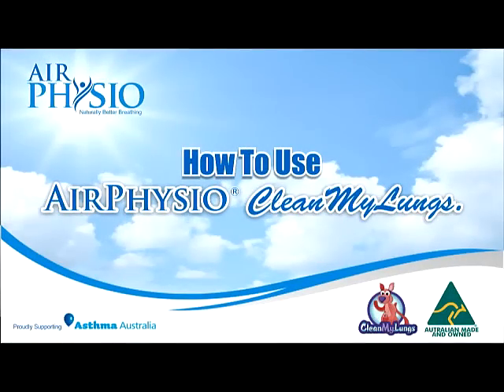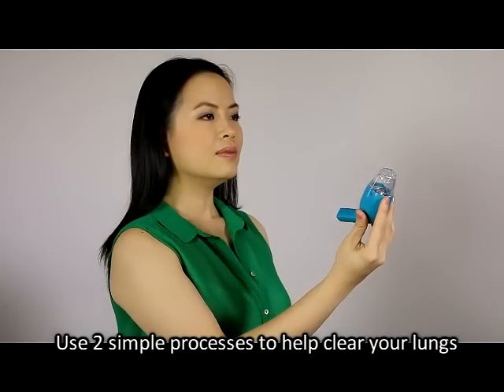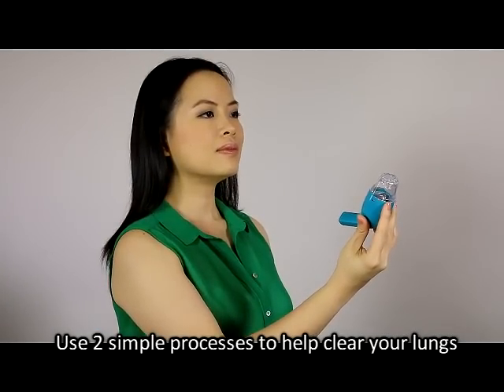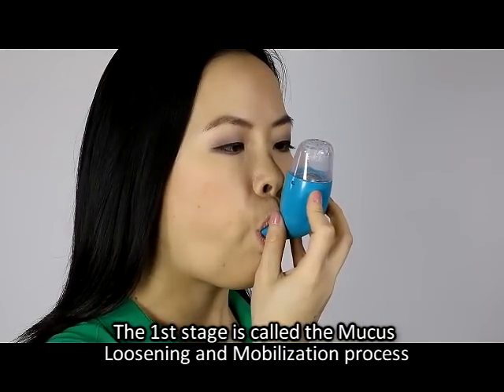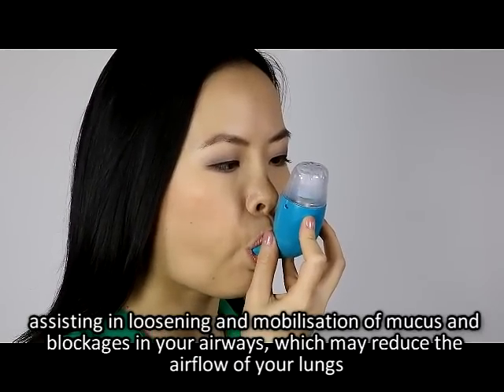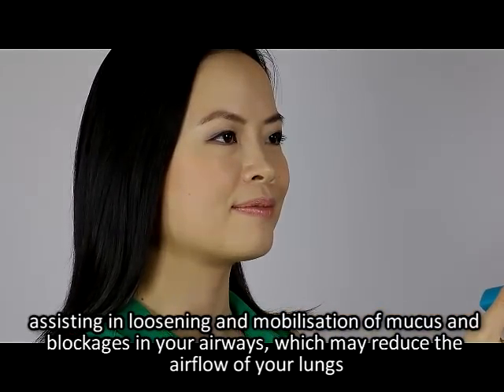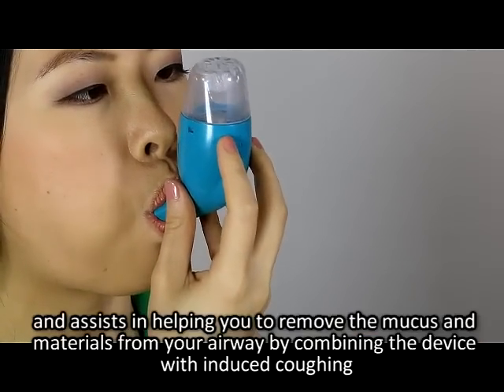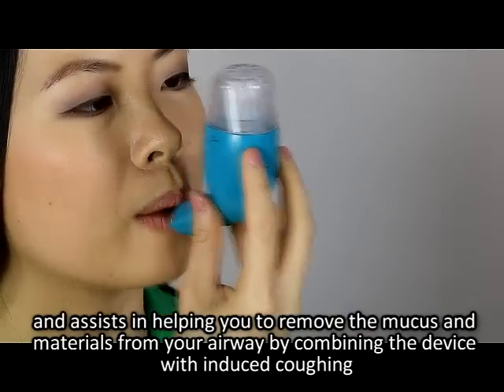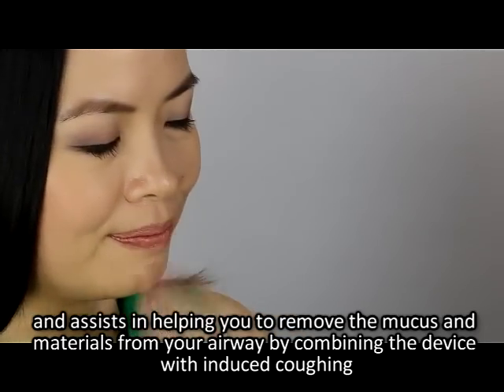How to use AirPhysio to clean your lungs. Two simple processes help clear your lungs. The first stage is called the mucus loosening and mobilization process, assisting in loosening and mobilizing mucus and blockages in your airways, which may reduce the airflow of your lungs. The second stage is called the mucus elimination process, and assists in helping you remove mucus and materials from your airway by combining the device with induced coughing.